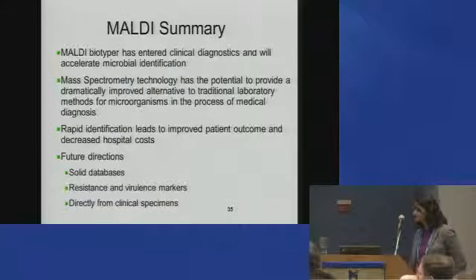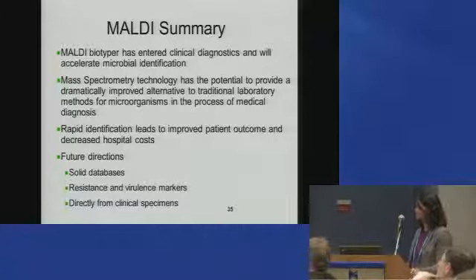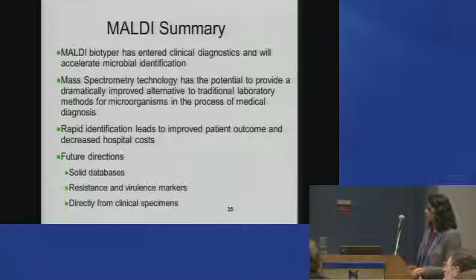So in summary, we are very excited that MALDI has entered clinical diagnostics for ID purposes. It really has huge potential and is already being put in place right now in terms of how it's helping us get quicker answers and for patient care. I think I've shown you some examples where you've seen improved patient outcomes and decreased hospital costs just by the implementation. The future directions, I would say, would be solid databases. We really need to rely on our databases more and have these be really relevant.